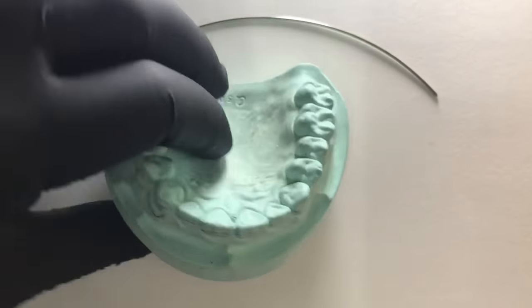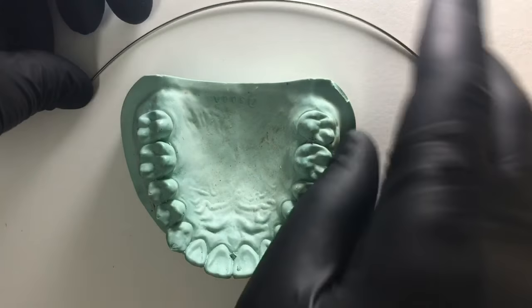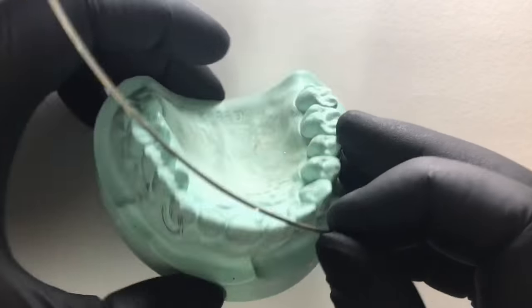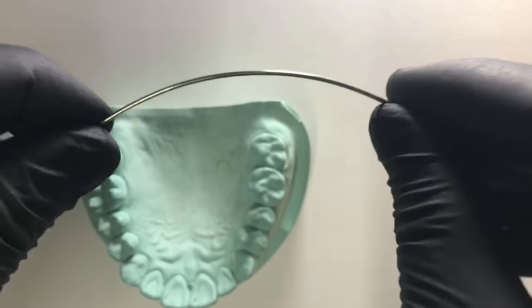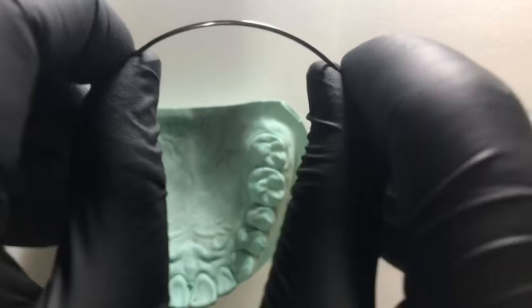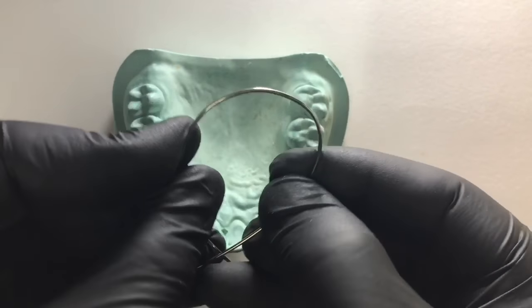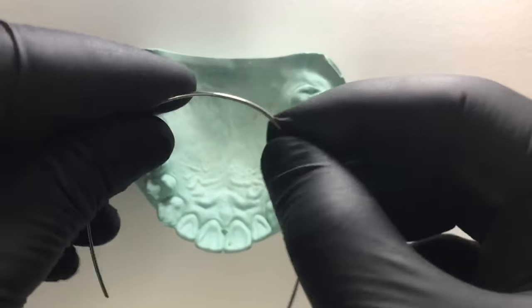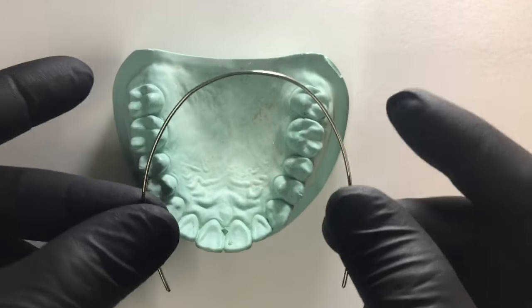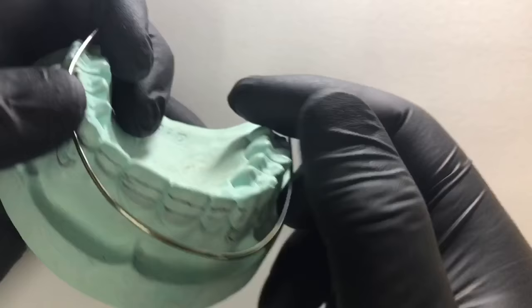These markings help us to avoid any errors. Now we can first form an arch from this wire. Remember we don't need to straighten up the wire; we roughly need this wire component to touch the outermost surfaces of the teeth in the arch, extending from canine to canine. With the help of finger pressure, we first need to form an arch. Remember there should not be any sharp bends and the plane should not be distorted.